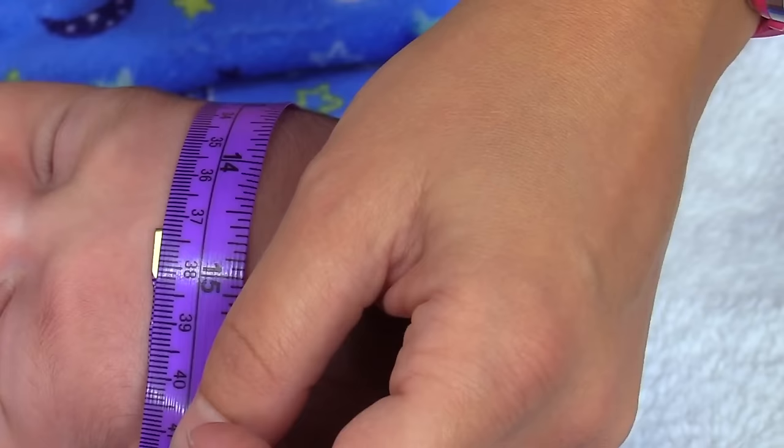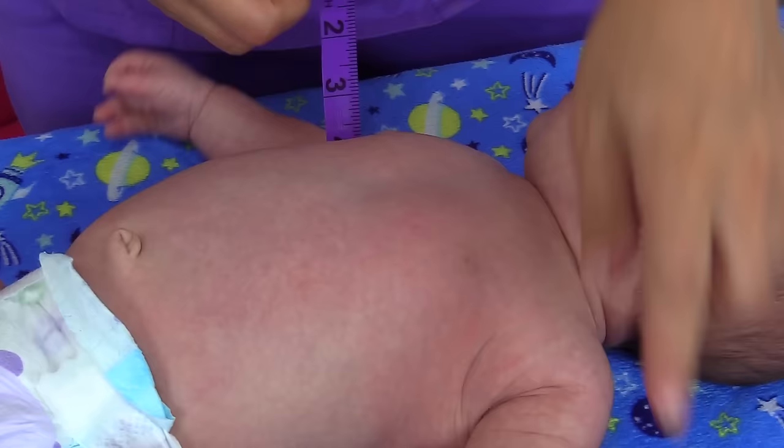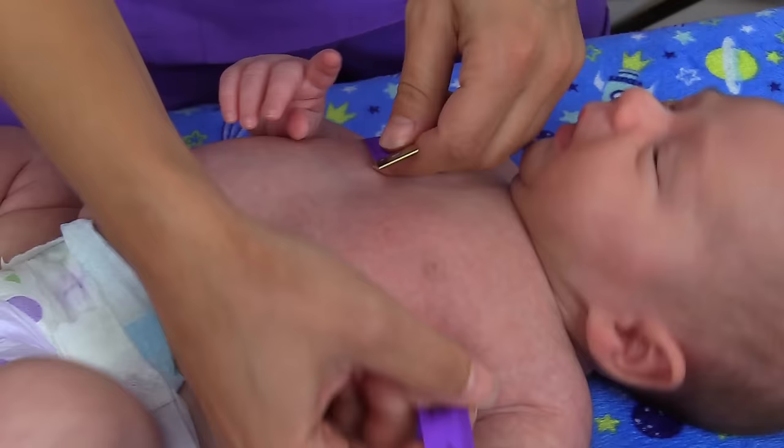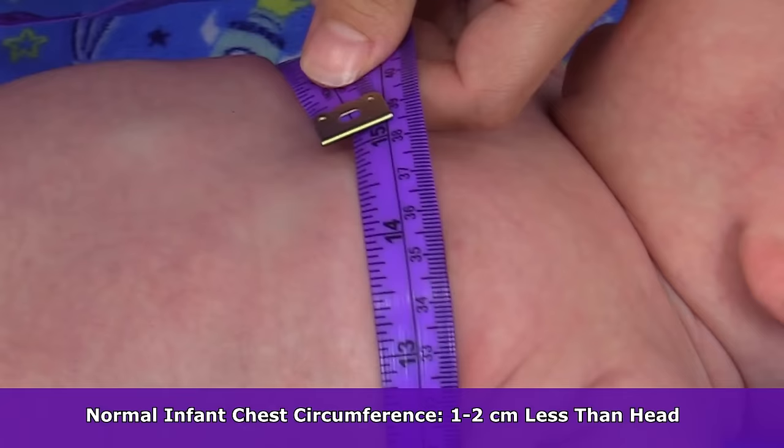To measure chest circumference, get your measuring tape — again measuring in centimeters. You're going to use the nipple line as your guide, wrap it around there, and measure. His is about 36 centimeters. This should be about one to two centimeters less than the head circumference. That wraps up this demonstration on how to assess vital signs on an infant. Be sure to check out the other videos in this pediatric series.